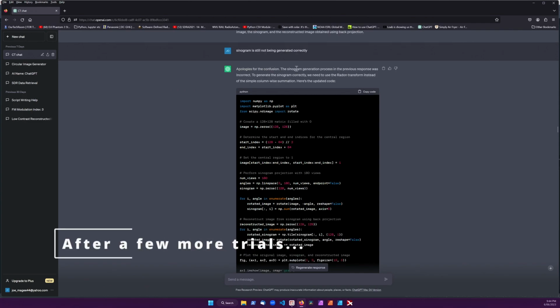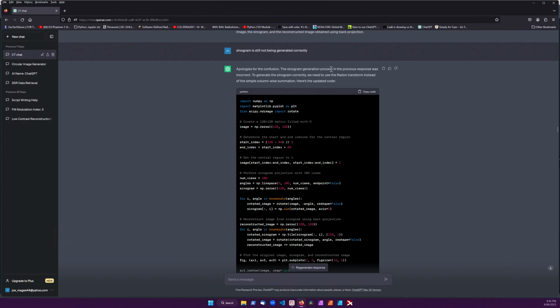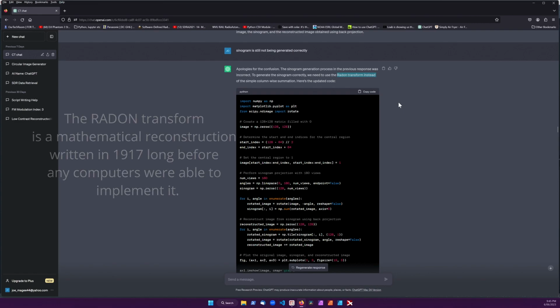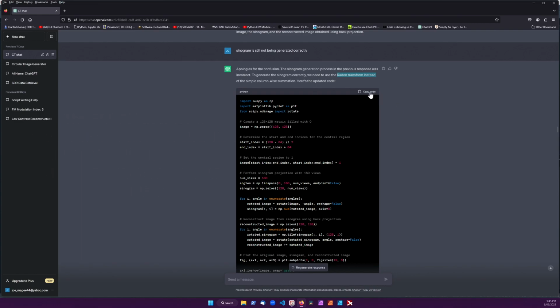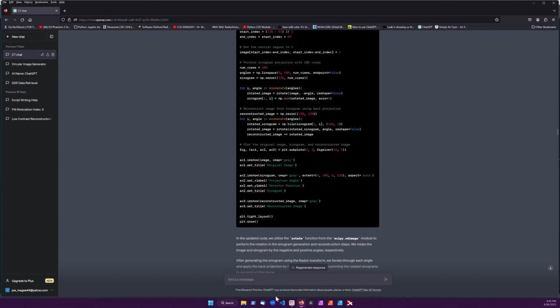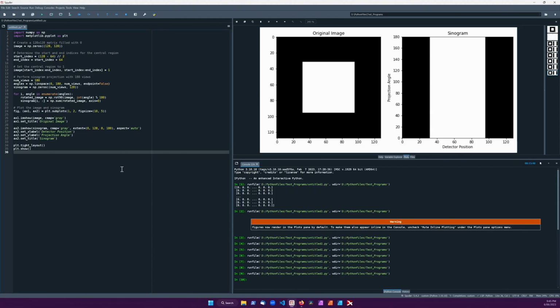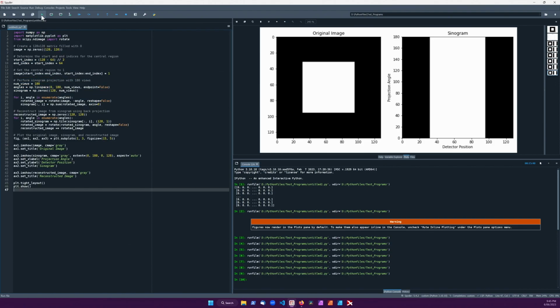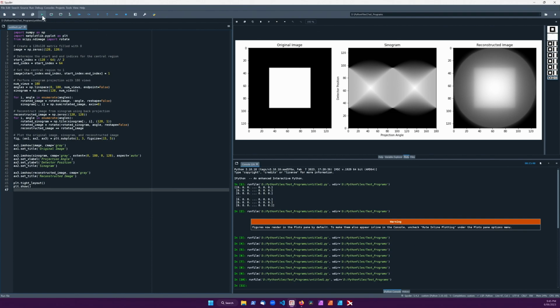So it comes up and says, apologies for the confusion. The previous code used to generate the sinogram, we need the Radon transform, and this is where it brings it up by itself without me prompting it in any way. So we'll copy that code once again. It's giving me new code, which is getting slightly longer with every iteration, but still very short. There we go, and we do that, and all of a sudden here we have a CT image which is essentially correct.